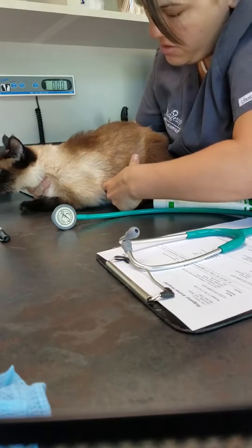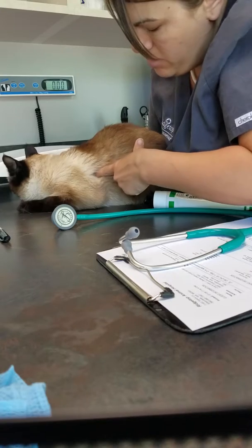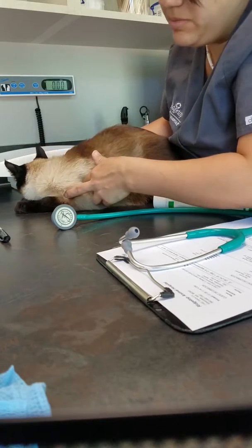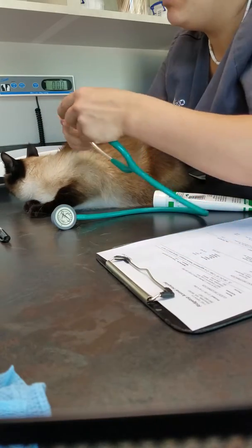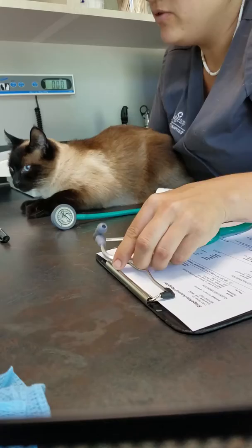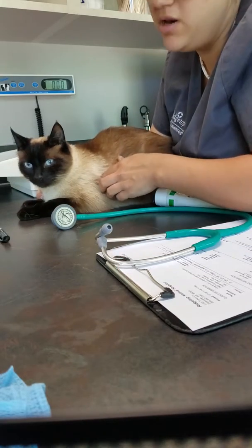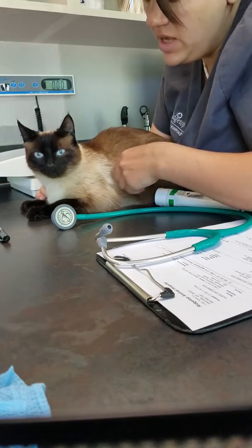Your pulmonary would be down here, your aorta would be up here, and then your mitral valve would be over here, and then your tricuspid would be on your right side over here. So when we're listening, we can listen for any murmurs, and then you could kind of tell where the murmur is originating from based on where you place your stethoscope on the PMIs.